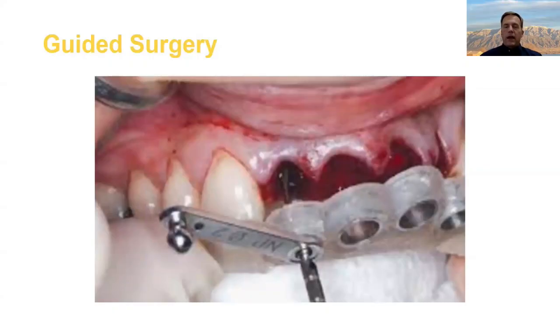I would say that guided surgery can be a unique benefit in this area. Of course, every implant can be placed with an unguided freehand procedure. But I would say that with the advent of CBCT scanners being so prevalent, almost every implant could be placed guided as well. Of course, freehand surgery is less costly and easier to schedule.